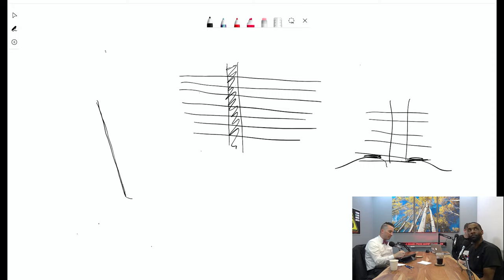When we're really trying to do this, I'm doing kind of a top-down thing for our superior sagittal sinus, dumping down into our jugulars, for MRVs. So full brain MRVs. If I were to go straight ahead, the superior sagittal sinus is going to look awesome. But when I get to the back right here, I'm going to have that in-plane flow, that in-plane saturation.